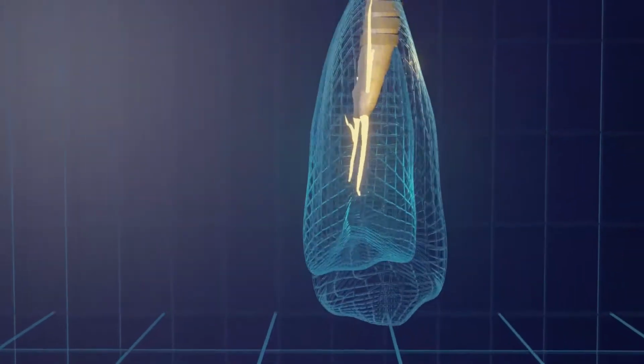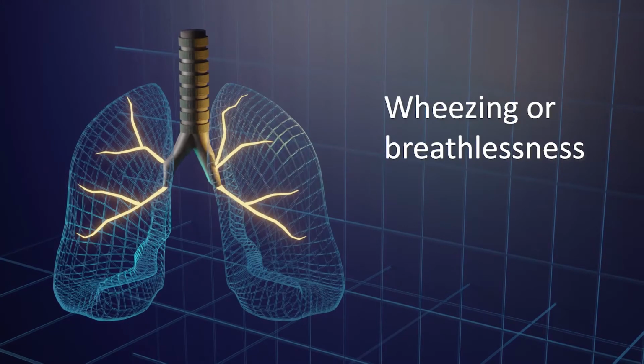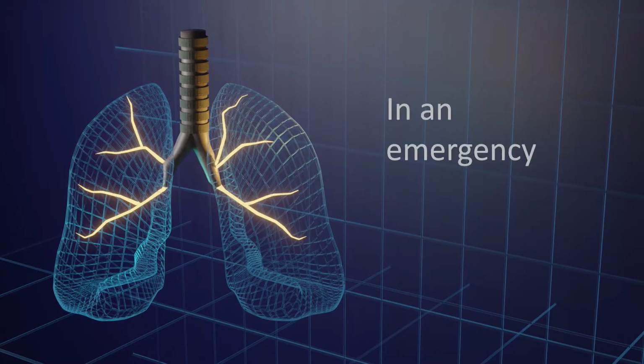A nebuliser may be used in addition or alongside inhalers to treat symptoms such as wheezing or breathlessness, with bronchodilators, drugs that work by opening your airways. In an emergency, if you are struggling to breathe, this is something that you may have been given by a paramedic or hospital staff during an admission.